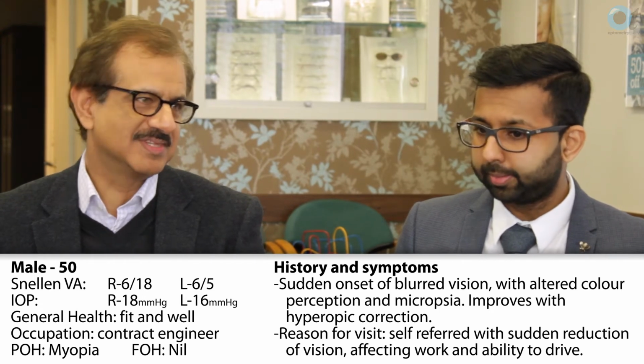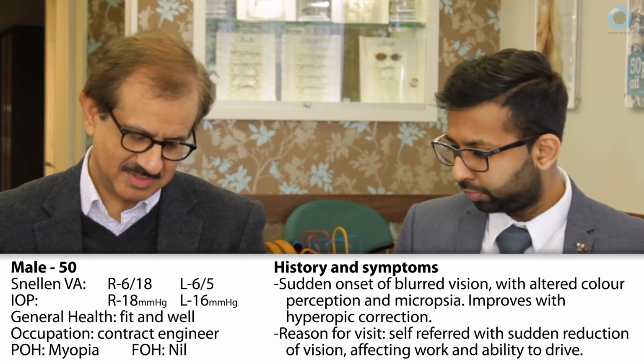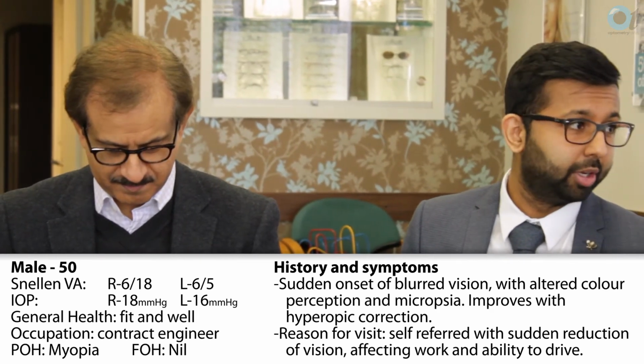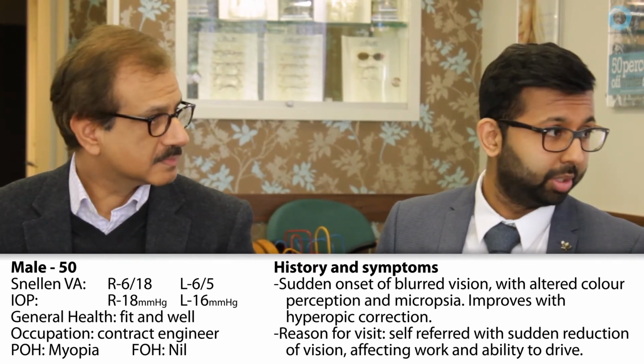I'm fairly confident this isn't a wet macular degeneration, because it doesn't tick the boxes for me. That's exactly the same, yeah. Definitely refer it via the GP soon. And I wouldn't put it through a wet AMD fast track.